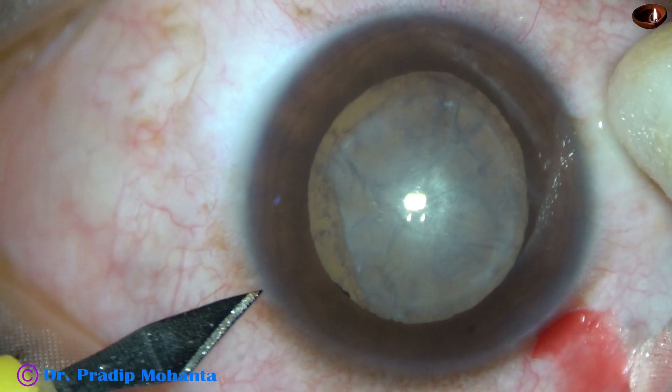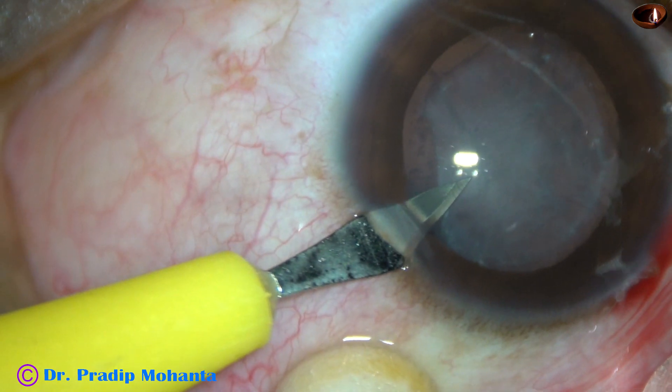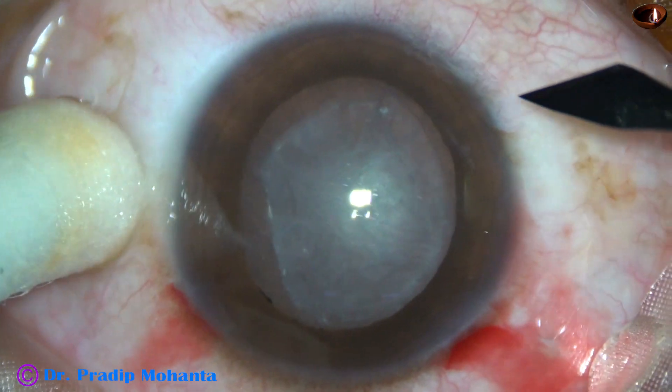My plan is to do this cataract surgery, and then hand over the case to a vitreoretinal surgeon.